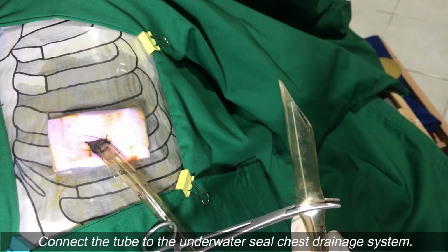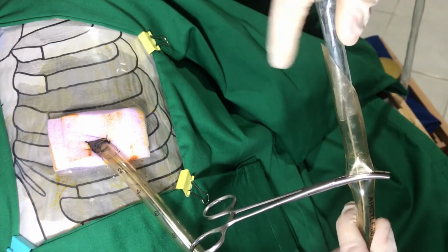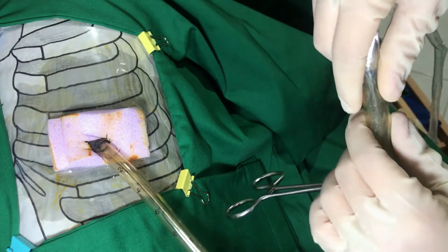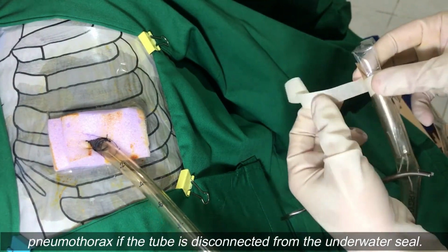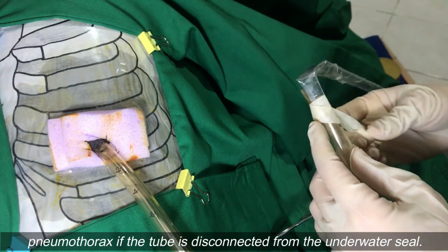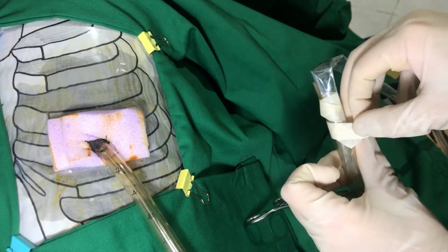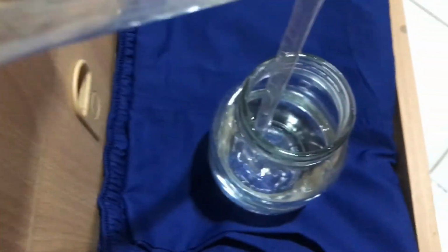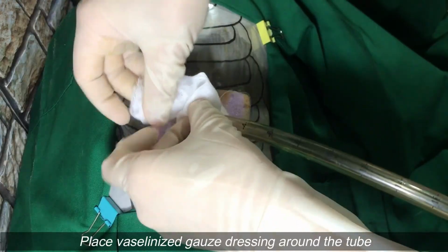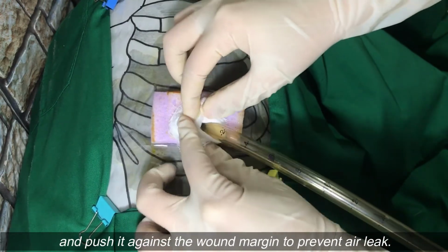Connect the tube to the underwater sealed chest drainage system. Properly secure the two connecting tubes, as this may cause pneumothorax if the tube is disconnected from the underwater seal. Place a Vaselinized gauze dressing around the tube and push it against the wound margin to prevent air leak.